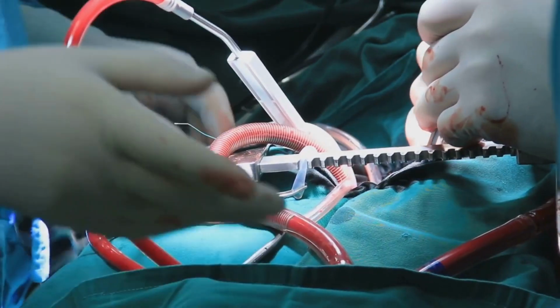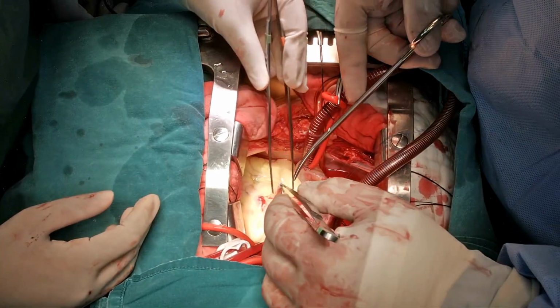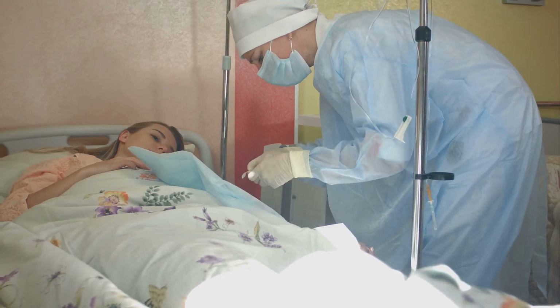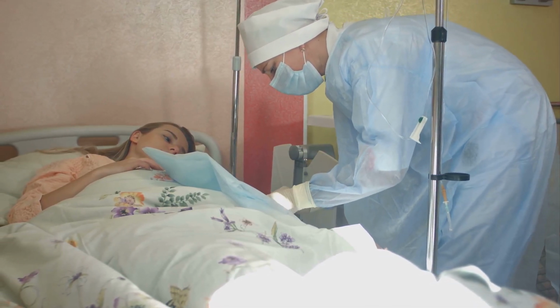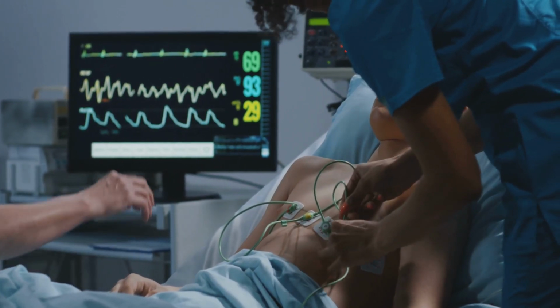Next, I monitor the amount, color, and consistency of drainage. Bright red, rapidly increasing output is a red flag, especially in mediastinal tubes. Any unexpected changes? Notify the provider immediately. When it's time for a dressing change, I use sterile technique, inspect the site, and reinforce the securement device. Never clamp a chest tube unless specifically ordered. Clamping can risk tension pneumothorax or cardiac tamponade.